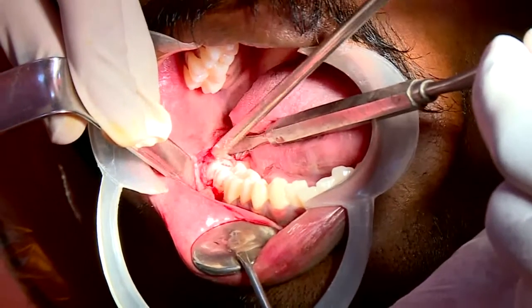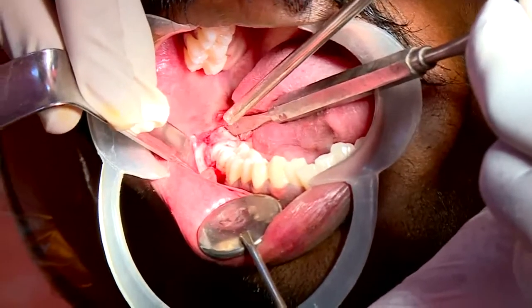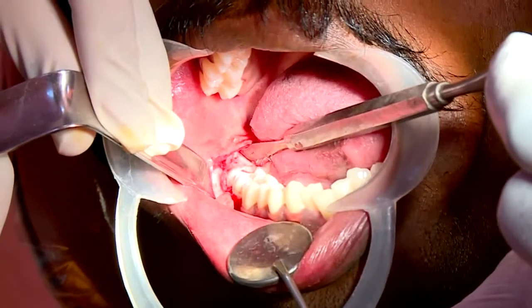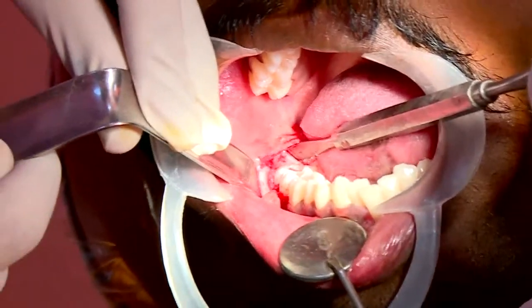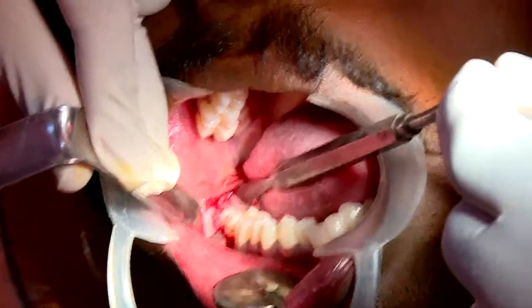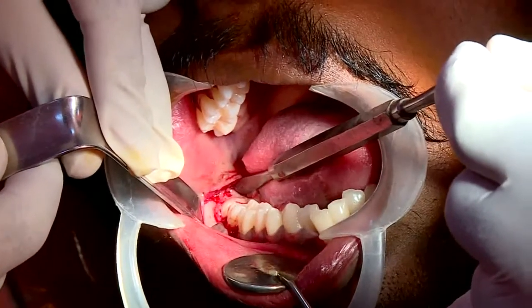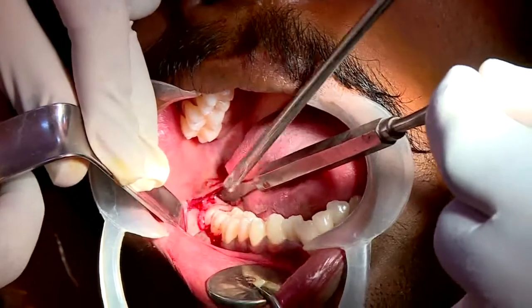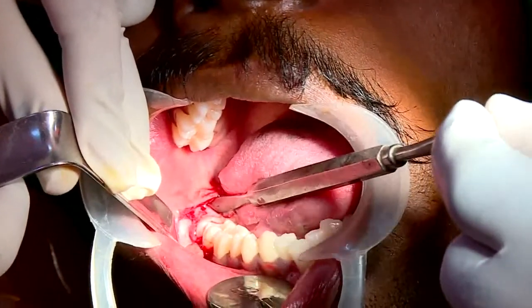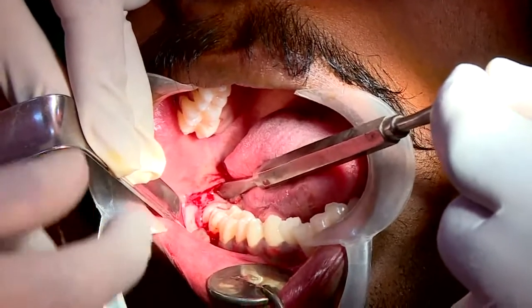The mucoperiosteal flap is elevated. The purpose of the mucoperiosteal flap is to expose the bone for better access for tooth sectioning, as I explained. Now the impacted tooth is exposed. The exposure should be on the buccal side and on the distal side, because we need to cut the bone both on the buccal side and on the distal side. On the lingual side, the bone guttering should not be done.